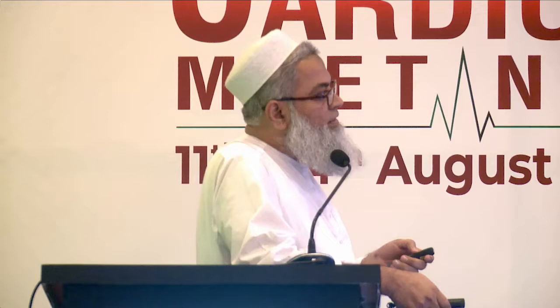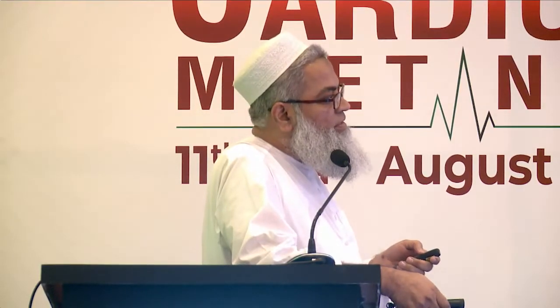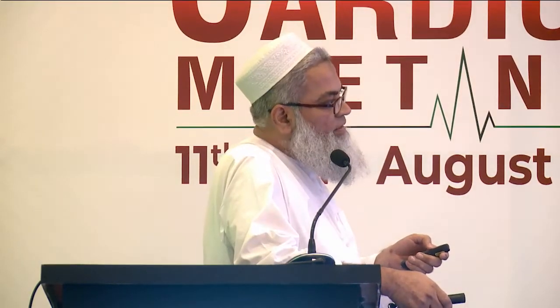So next is, I'll come back to this one later. First, I want to tell you this thing. I'll come back to this image later. So this is the left lateral position. In left lateral, you have the pigtail in front, the spine at the back, and this septum. I just told you that this septum has a vertical part and a horizontal part. I want to prove it.